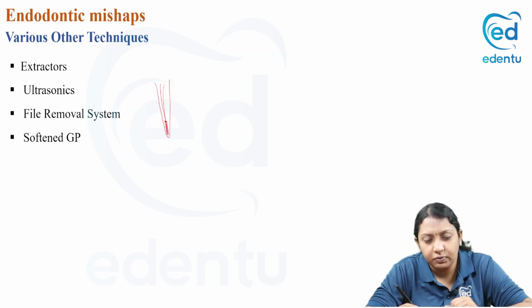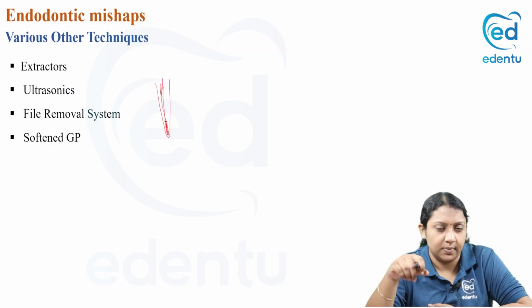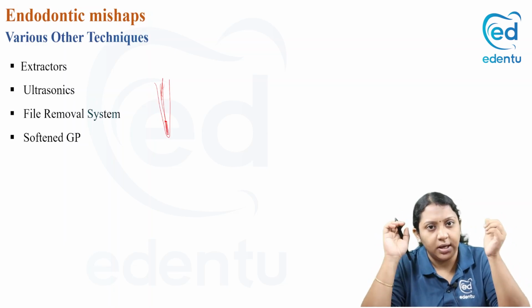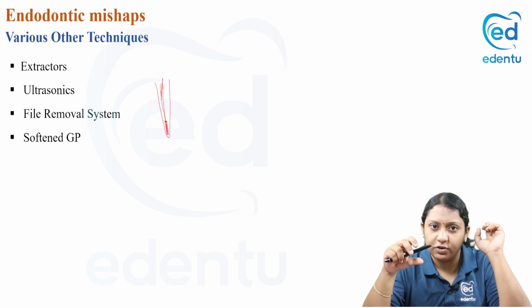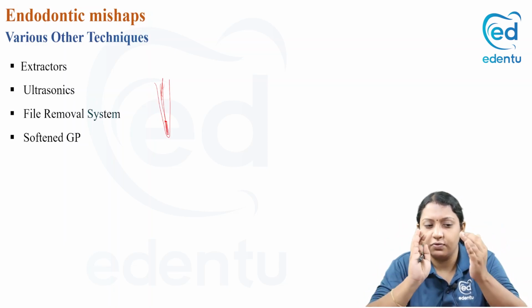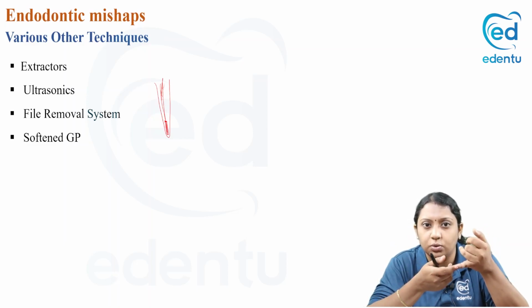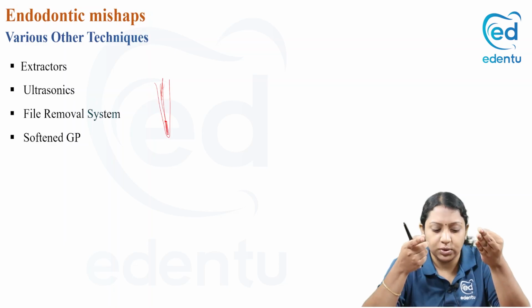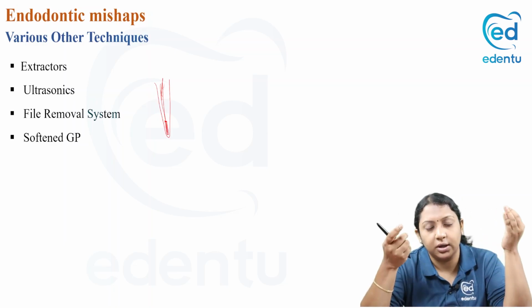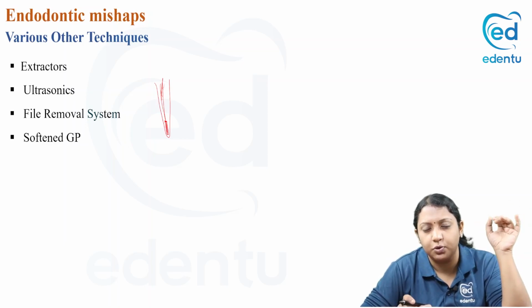With ultrasonics, we create a platform for the engagement of these instruments. So before going into any instrument retrieval system, we first have to see that a platform is created with ultrasonics. Once the platform is created, any of these measures can be used: braided files, wire loops, several other extractors, the Masserann kit, canal finder systems, or post removal systems.